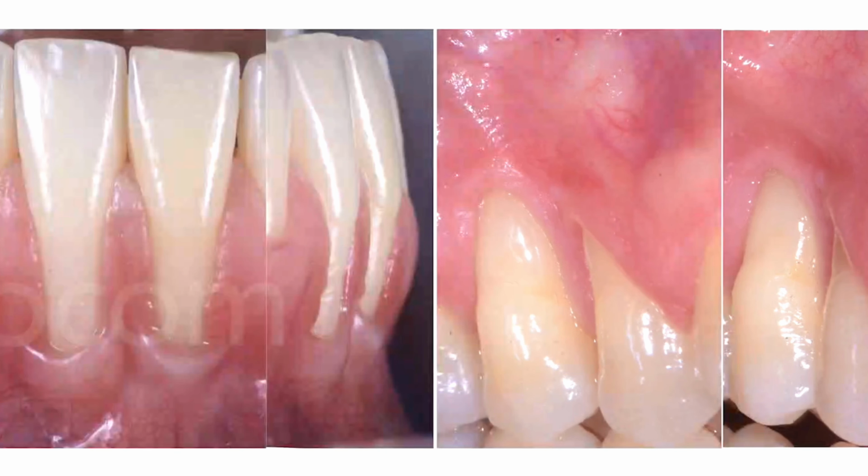This, for example, is another condition where the papilla is narrow, yes or not? But despite this papilla being narrow, you can see this papilla is located at the same buccal level, more or less, of the root. So in terms of blood supply, this papilla gives much, much more blood supply compared to the avascular surface that you have to cover. And this is something that you have to recognize because nobody tells you. If you look at the literature, they tell you that the only factor determining root coverage is the level of the attachment. And here the level of attachment is perfect. And so if you don't achieve complete coverage, you think maybe it's a fault of yours, which is not true.